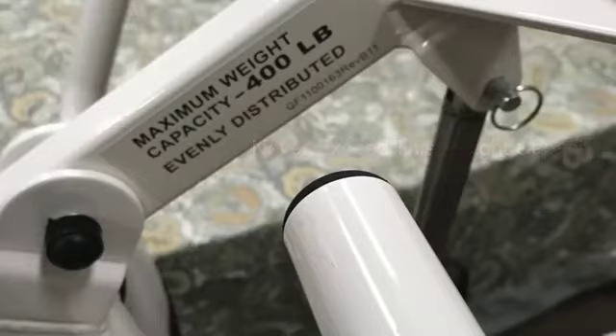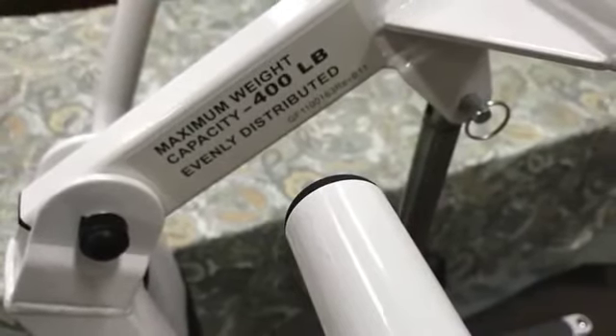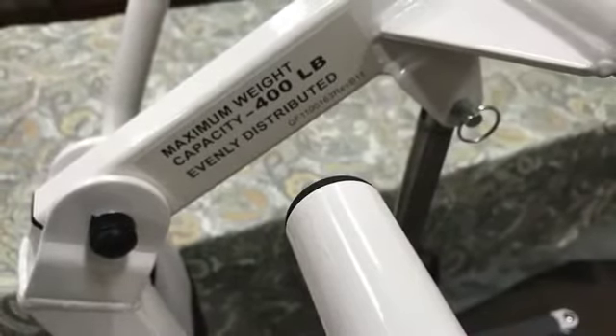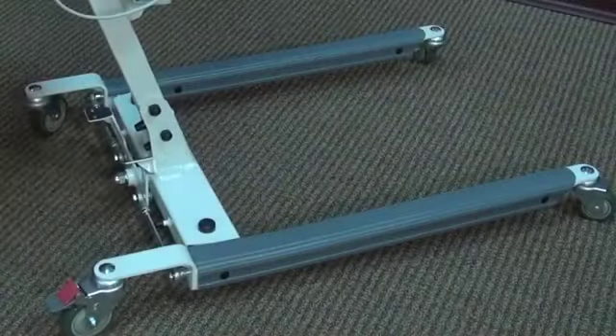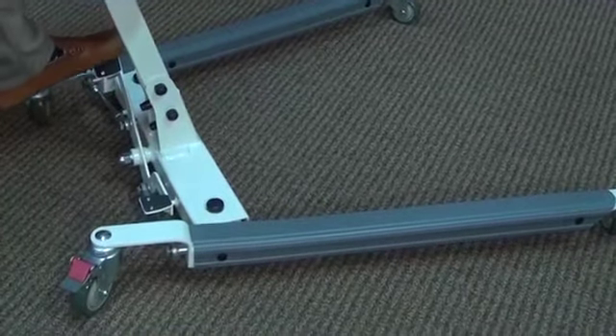The weight capacity of the LF 2020 lift is 400 pounds. The weight capacity of the LF 2090 is 600 pounds. This is clearly marked on the boom. Never exceed this weight capacity for your safety and for that of your resident. The lift is equipped with a safety chip that will sound if you try to lift too much weight. The lift will emit four quick beeps and then stop if you try to exceed the weight limit.